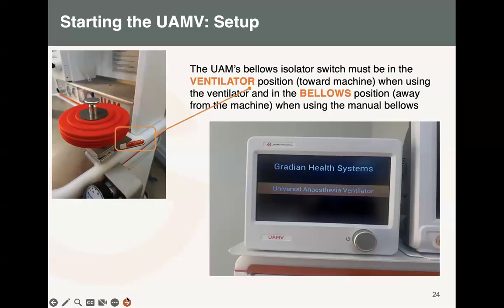And there's something I would have to emphasize here. Once you finish your machine check, please review your alarms. Alarms should be reviewed, and you should set the alarm depending on the case you have, whether it's a pediatric, or an adult, or whatever. And remember, each case has its own tolerance. So there should not be a so-called universal alarm, whereby there are some anesthetists, our colleagues, our friends, who never look at the alarm.